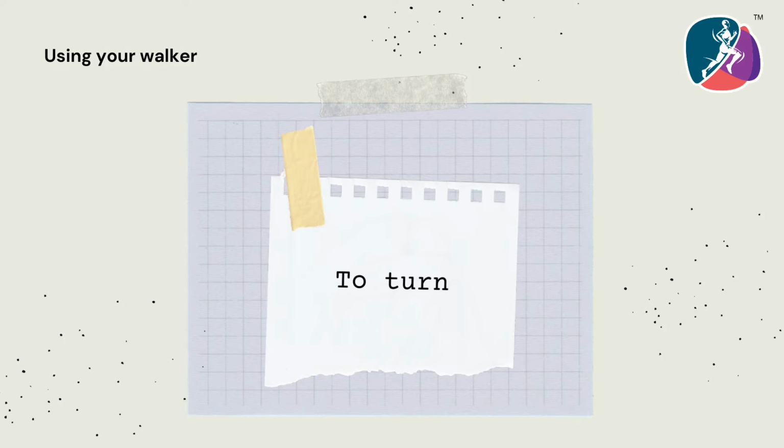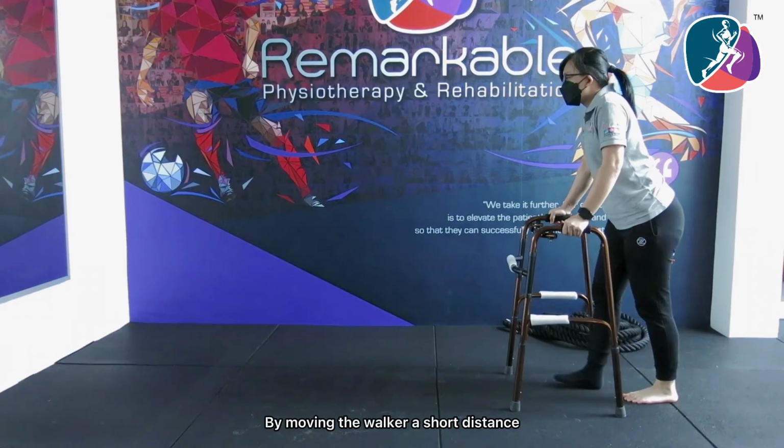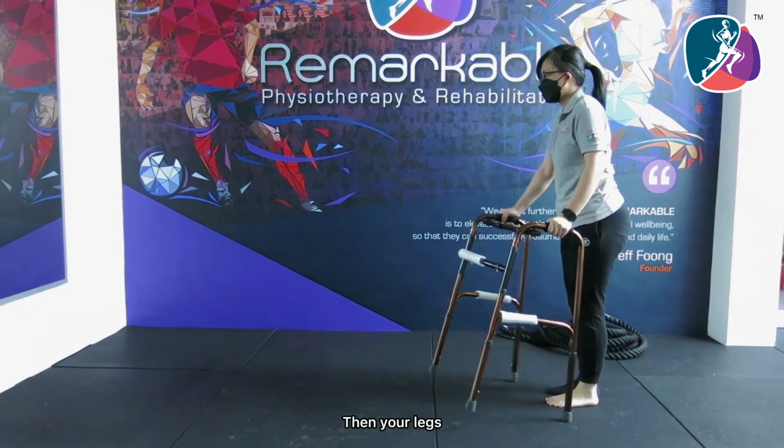To turn, take small steps when you turn by moving the walker a short distance, then your legs.